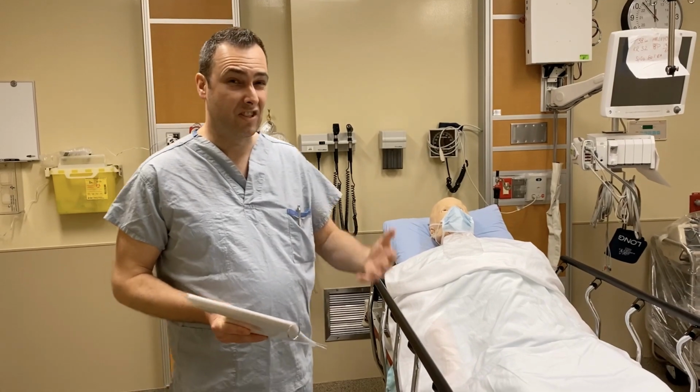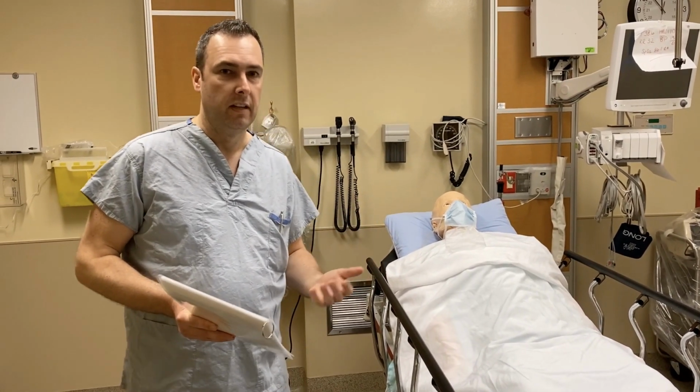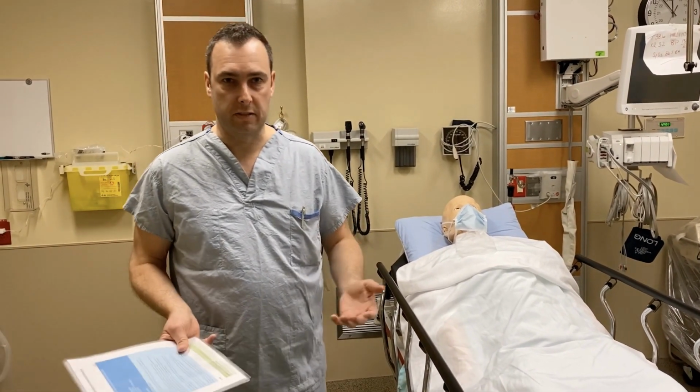We have a patient here today. His name is Mr. Covey. He's 60 years old, and we've already made the decision that we need to intubate this patient. And we're going to do so in the emergency department as the ICU is full.